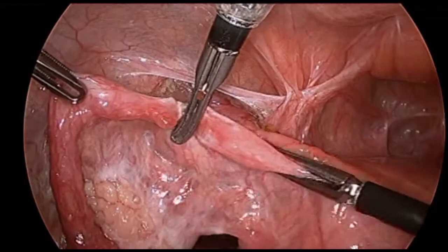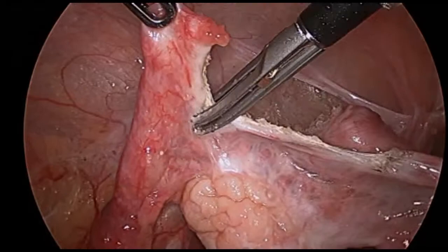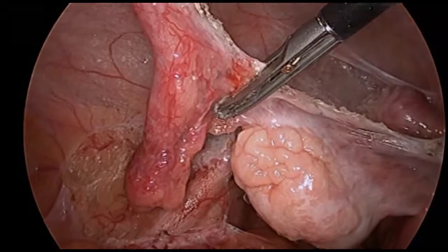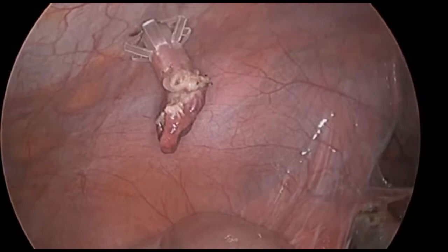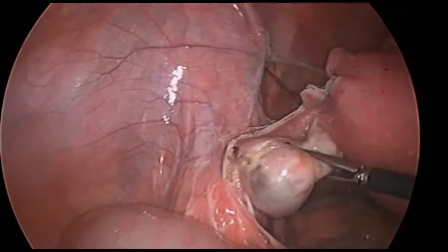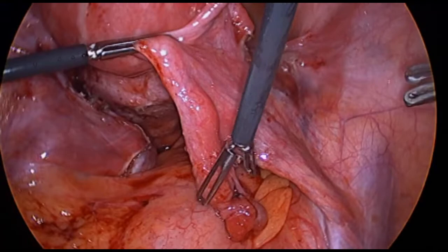In this scenario, we begin our dissection near the uterine cornue. We seal and divide the fallopian tube at the cornue until the mesosalpinx is reached. Care is taken to ensure that the fallopian tube and vessel sealer are positioned in parallel to optimize surgical efficiency. Sliding the vessel sealer upward while underneath the fimbriae ensures that no fimbriae are left behind. Once the fallopian tube is free, we recommend immediate removal as this small specimen can be easily lost within the pelvis.